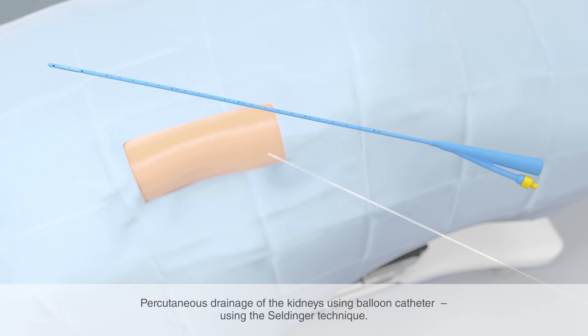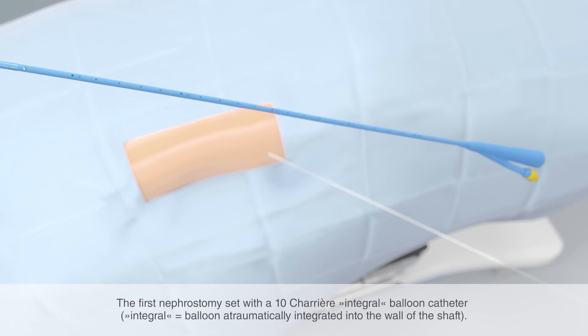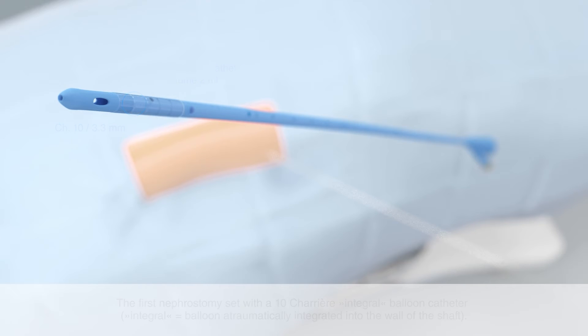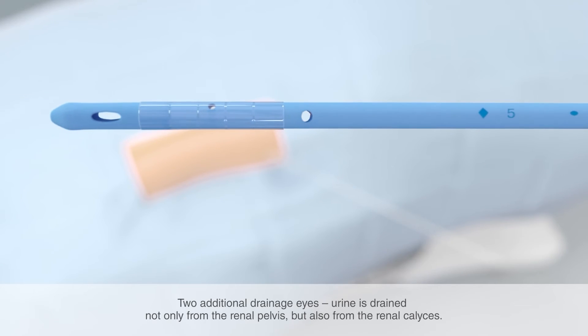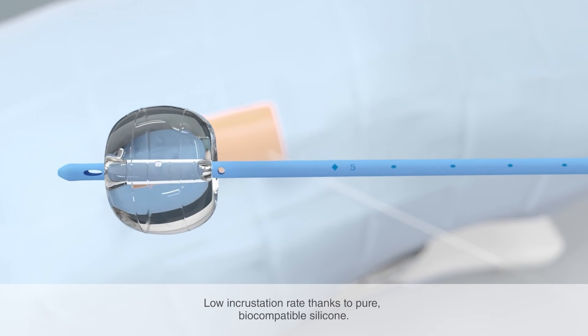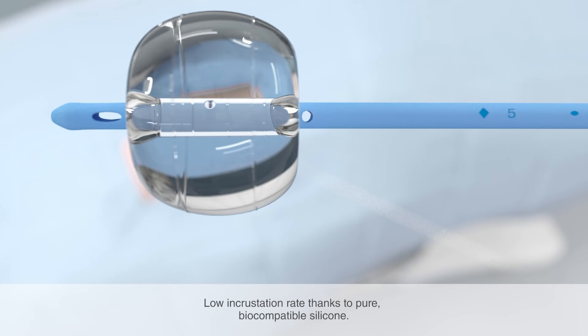The balloon catheter NephroQuick is used for percutaneous drainage of the kidneys. It is placed using the Seldinger technique. The Uromed balloon catheter set NephroQuick is the first nephrostomy set with a 10 Charrière integral balloon catheter. The integral balloon integrated into the wall of the shaft allows the catheter to be changed largely without pain and overcoming the fascia is easier. Besides the drainage eyes at the catheter tip, the catheter has two additional eyes for calyceal drainage behind the balloon, meaning urine can be drained not only from the renal pelvis but also from the renal calyces. An alternative product without the two additional eyes is reference number 2608. The semi-solid catheter is made of pure biocompatible silicone, which means the incrustation rate is very low.